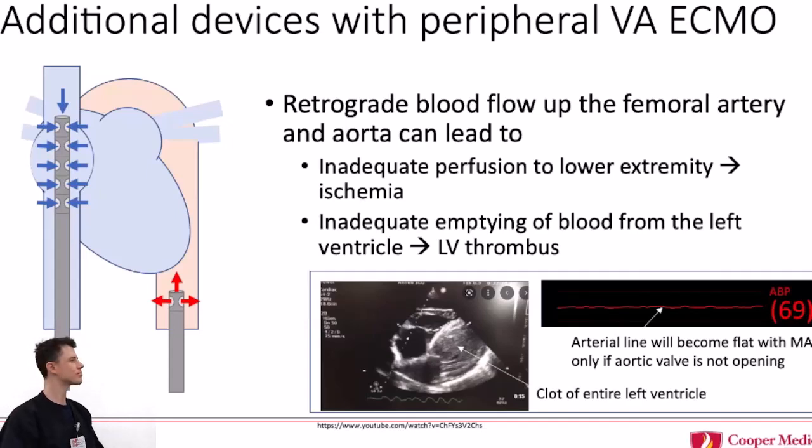Oh, your ability to wean your Impella. So when you're going down on your ECMO, you're able to go down on your Impella as your cardiac function improves, right? So you're weaning your Impella and your ECMO at the same time, and then you're able to decannulate or get off your ECMO, but you're still on maybe minimal settings of your Impella, right? Would that be ideal? Yeah, and it depends on how the patient's recovering, how fast you can do any of those things.